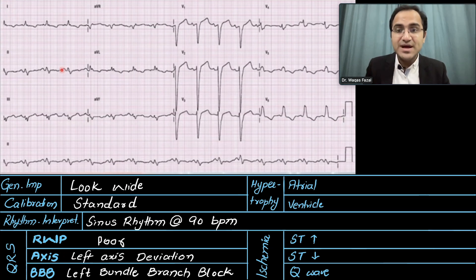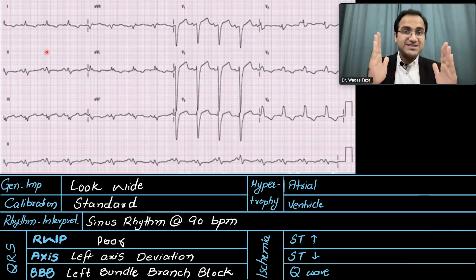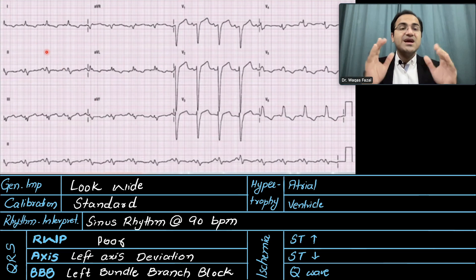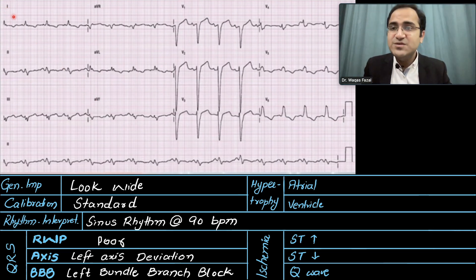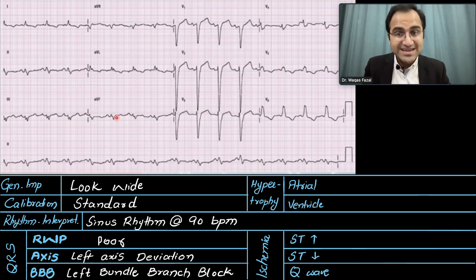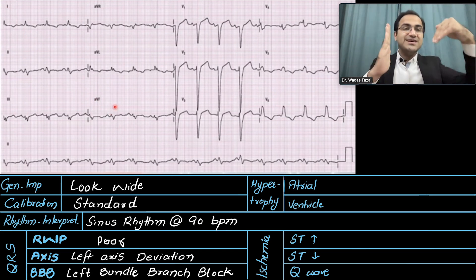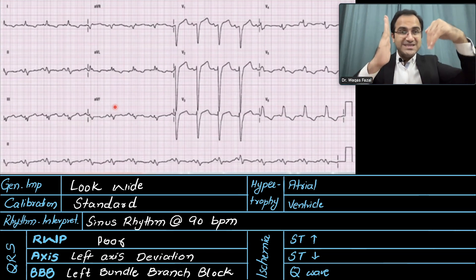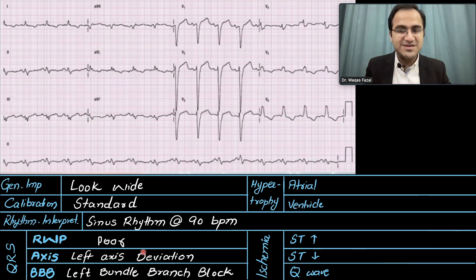For the axis, we look at lead 1 and lead AVF. If both QRS complexes are positively deflected that is a normal axis. In lead 1 it is positively deflected, but in AVF it is negatively deflected — they are pointing away from each other. In left axis deviation the QRS complexes diverge, so this is a left axis deviation.